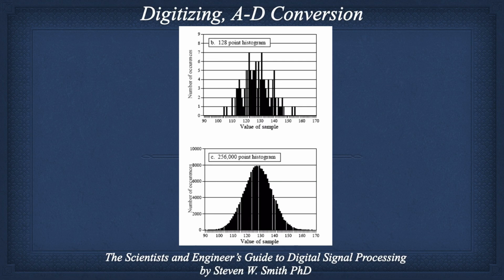Now, digitization is a little bit easier to see at first. Let's say we have a Gaussian electronic impulse. We can only quantize or digitize that a certain amount. It's not continuous. You send out that digital signal, and it depends on the number of bits you have how much you digitize it. You can poorly digitize it like up on the top, or you can digitize it on the bottom.